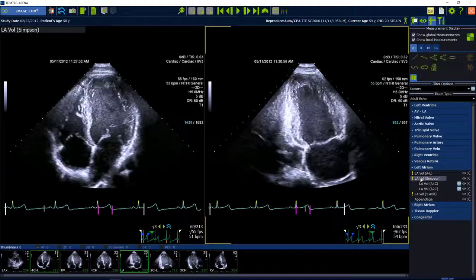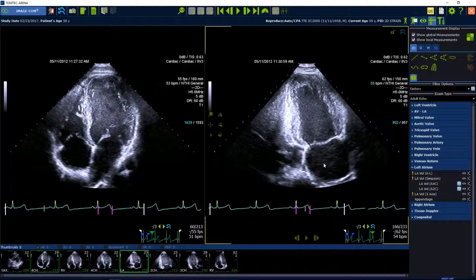The software expects the standard image orientation, so if needed please use the flip or rotate button in the smart regions to correct your image orientation.